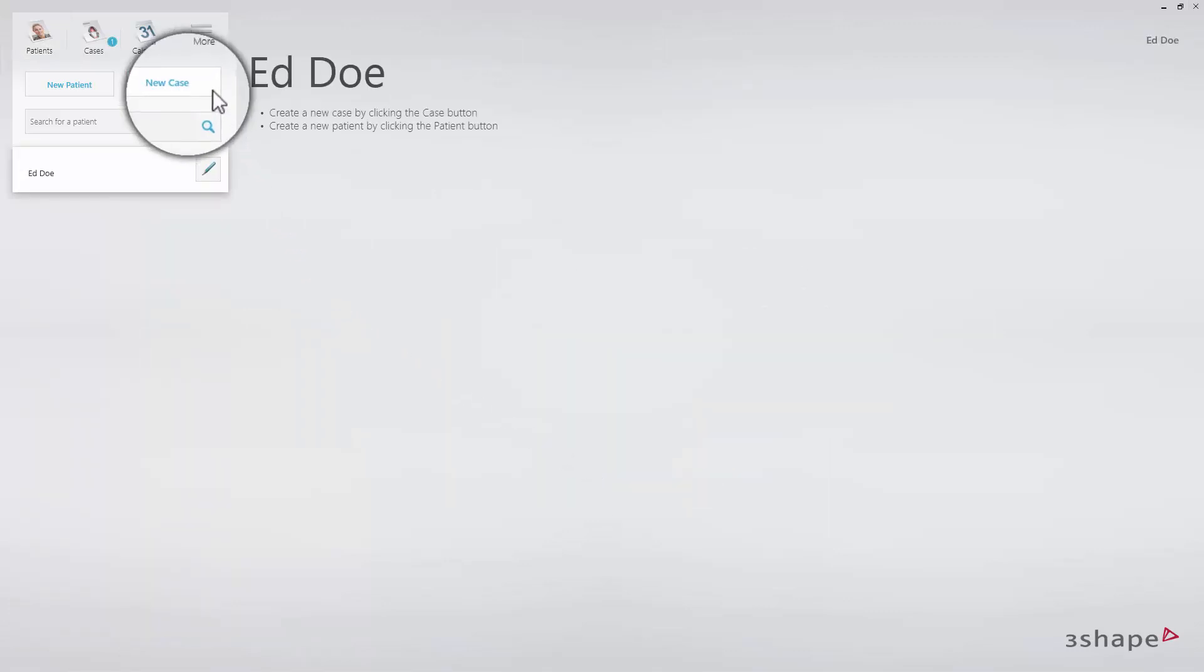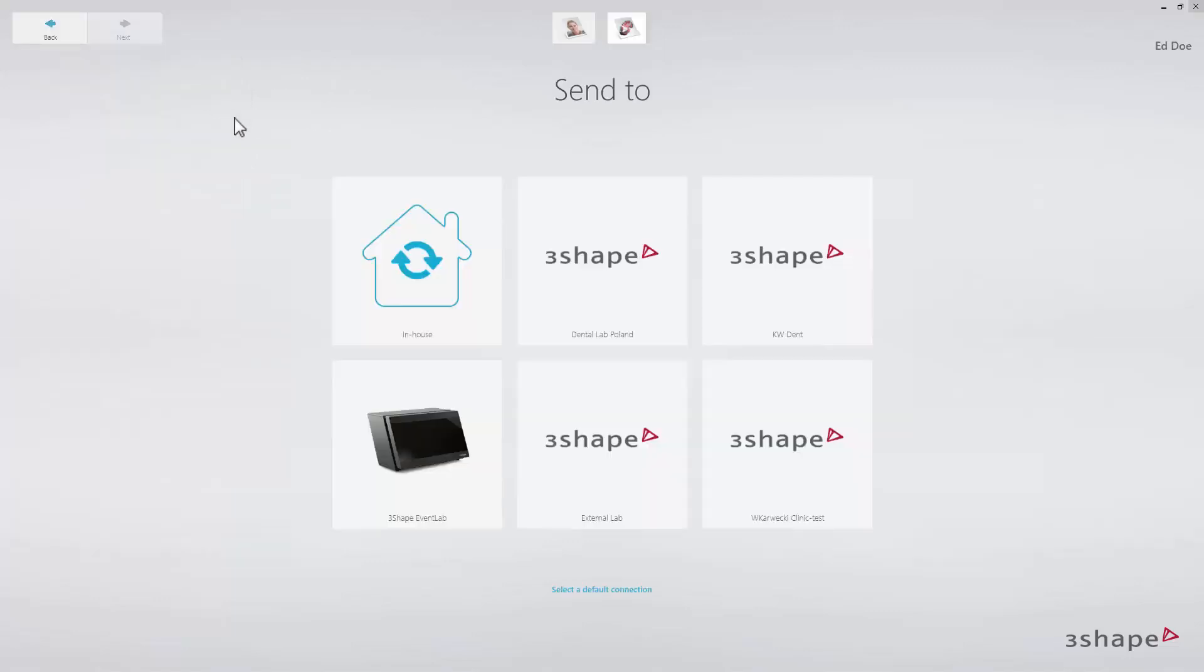Click new case to create a case for the patient you have just created and which is now selected. Select who to send the case to, choose between in-house or any of the lab or partners you have registered in the system.